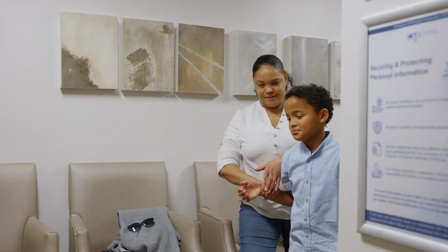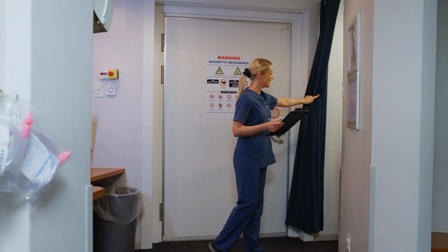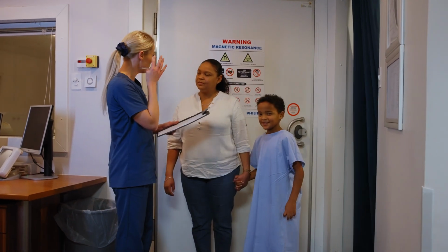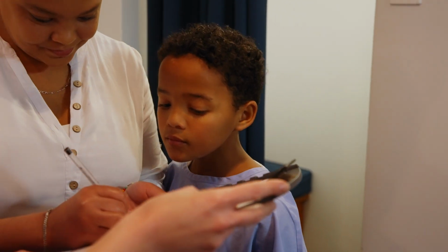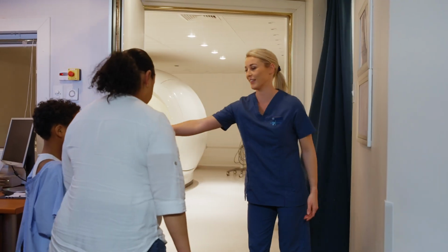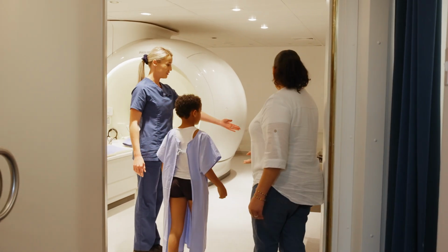When arriving for an MRI scan, the radiographer will meet you, go through an MRI safety questionnaire, and have you dress in an SCP MRI safe gown. We take extra care when scanning children because the process can be quite daunting for such a little human. Some of these conditions might include light sedation or full anesthesia. We do allow parents to be present while scanning a child because the comforting presence might help ease the child.